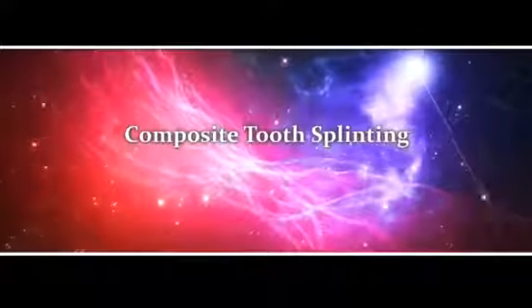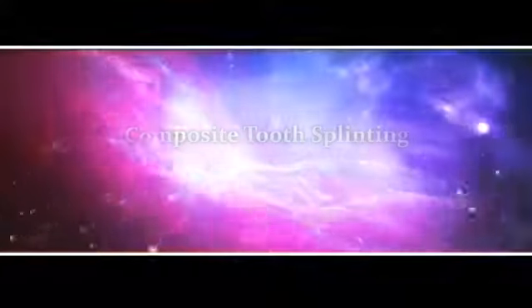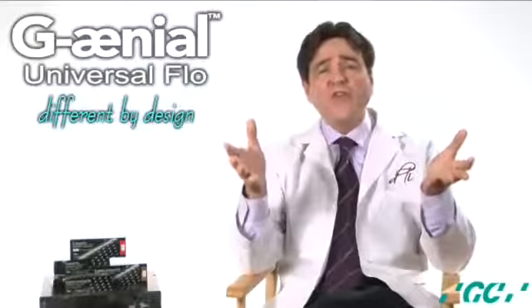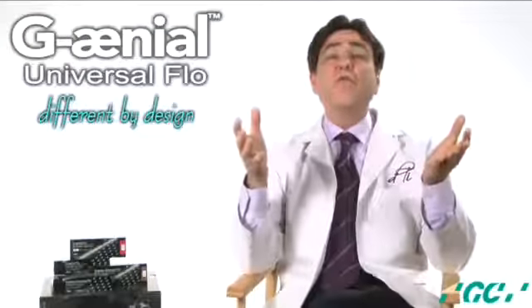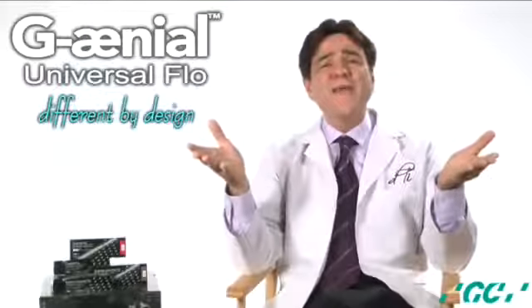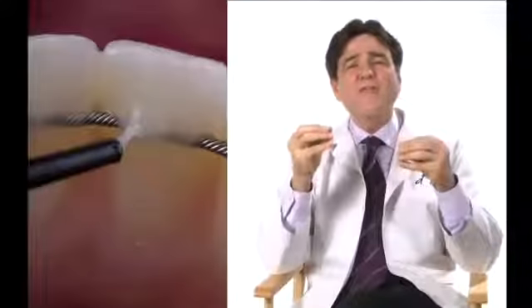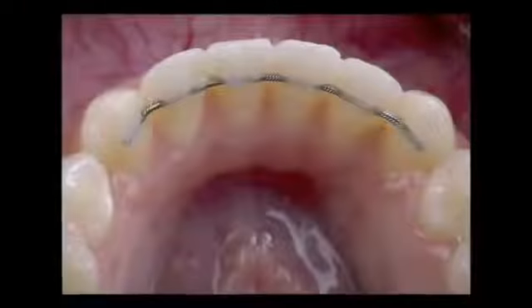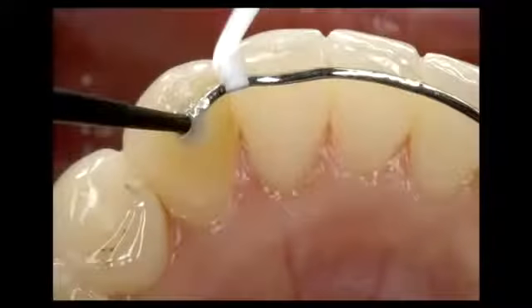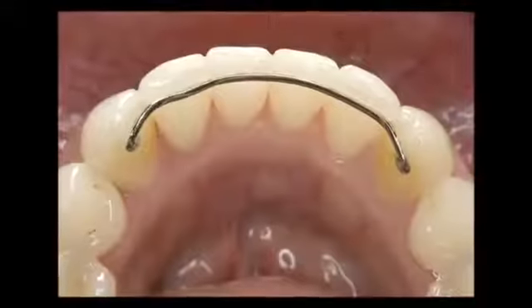For composite tooth splinting, composite tooth splinting has widespread use in dentistry for stabilization and immobilization of teeth, for orthodontics, periodontics, oral surgery, pedodontics, and general dentistry. It provides tooth fixation through application of a light-cured flowable or chemically cured composite material to acid-etched enamel surfaces in combination with flexible stainless steel wire, orthodontic brackets, or fiber-reinforced ribbon.